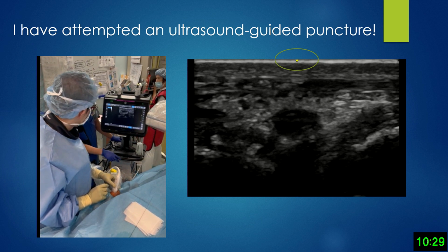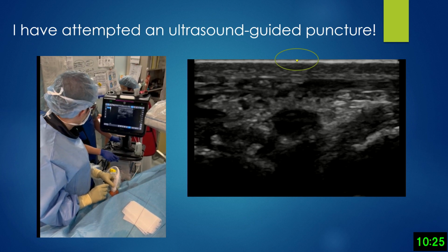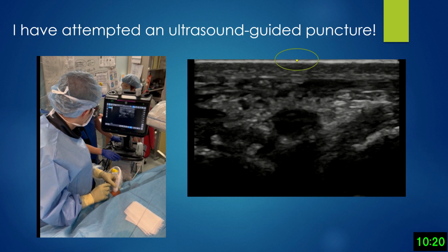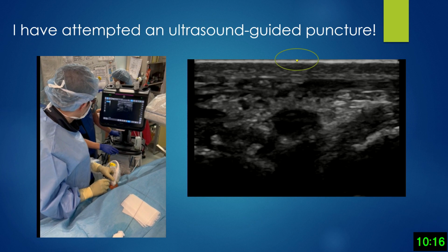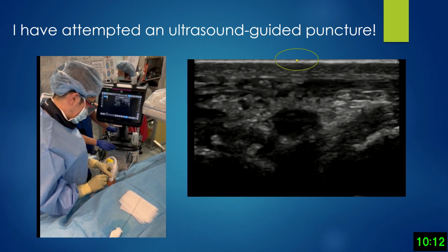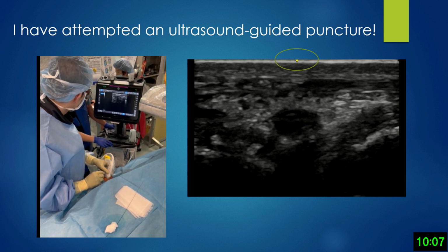As you can see, he appears to be having difficulty with puncture. But as long as the artery is visible on ultrasound, puncture can be successful unless you give up.